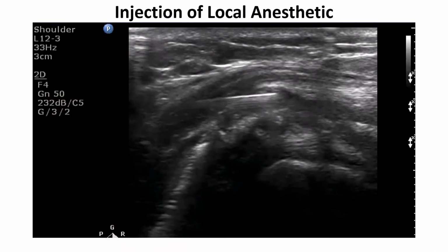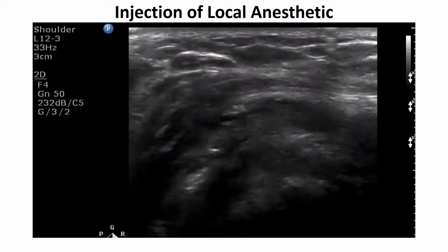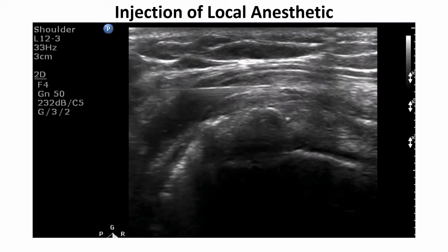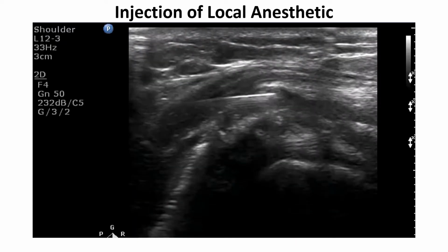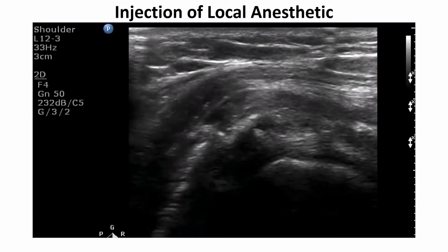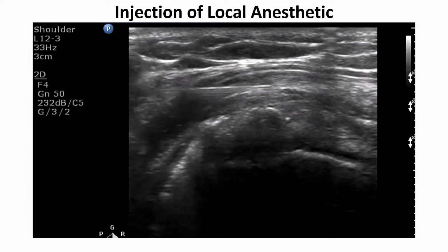This sono video demonstrates the needle entering to infiltrate the subcutaneous tissue above the calcium deposit. Please note the acoustical shadow underneath the calcium.